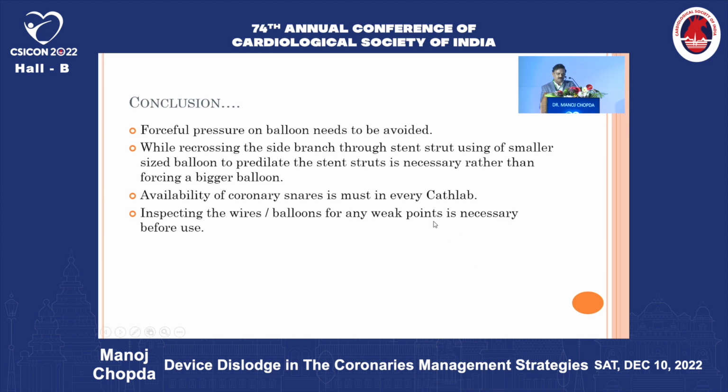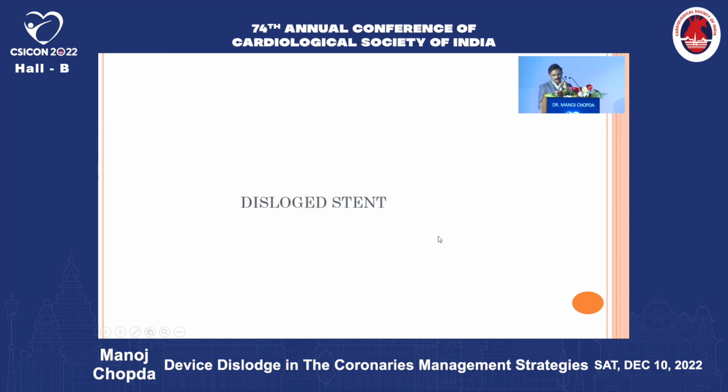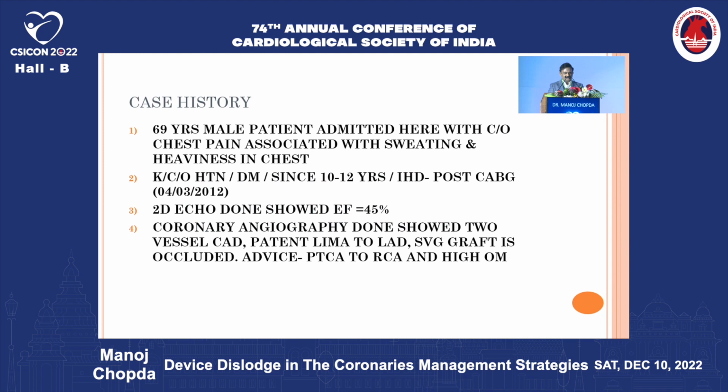Availability of a coronary snare is a must in every cath lab. Inspecting the wires and balloons for any weak points is necessary before use. Then there is a dislodged stent.